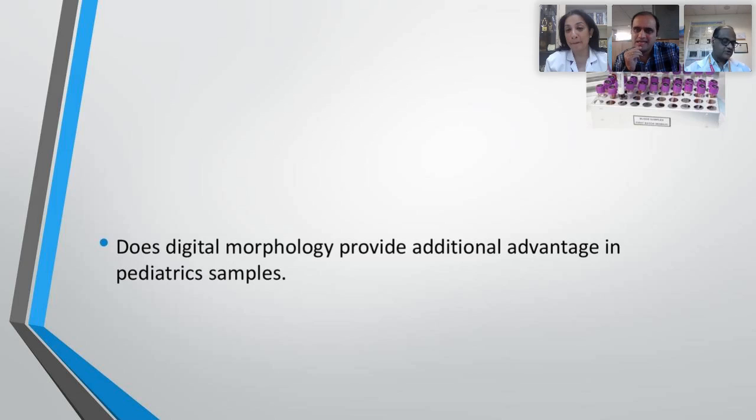Okay, I just got this. I'm reading from this paper, which is Digital morphometry analysis in hematology, the ICSH review and recommendations. I'm reading from the guidelines itself, written by Kratz et al., which says that for the pediatric samples, as Dr. Anupama was saying, the detection of lymphoblasts shows low sensitivity and specificity in the pediatric samples and shows the lowest rate of overall accuracy. So what Dr. Anupama is saying, I did read also, and I just wanted to tell you this is what it is.